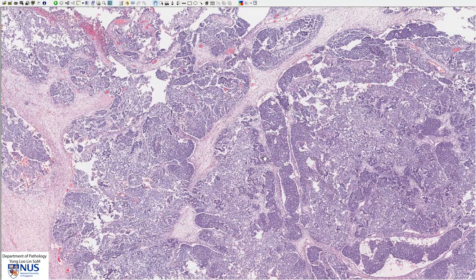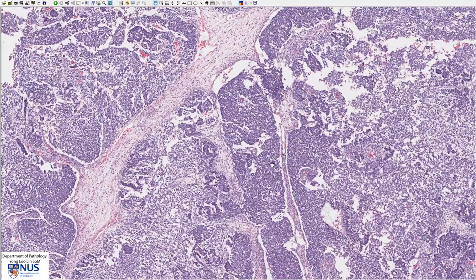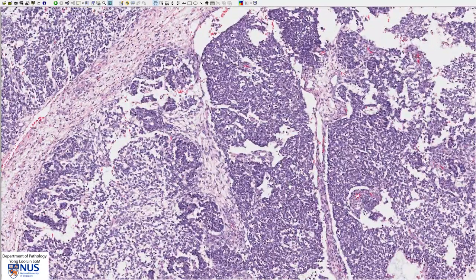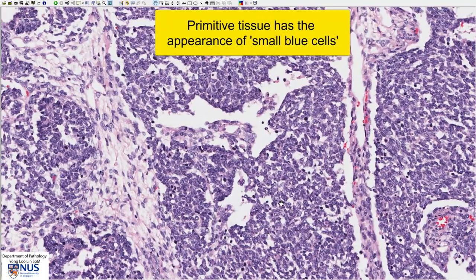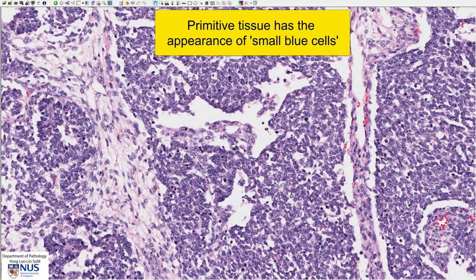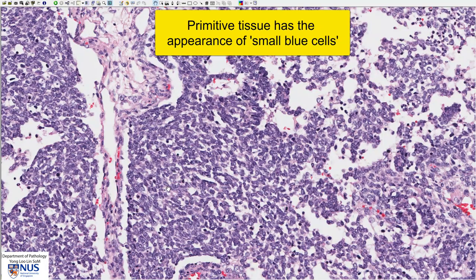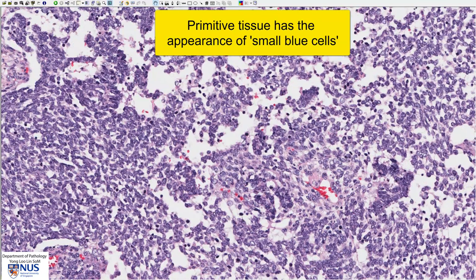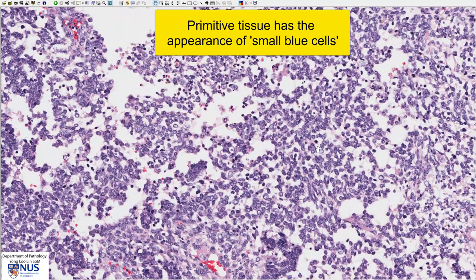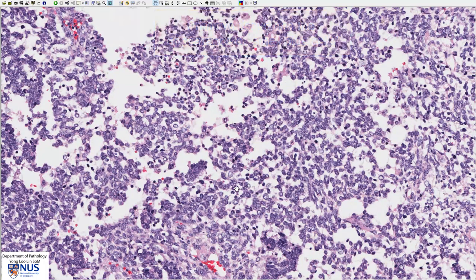In this area we can see a very blue appearance. Looking at higher magnification, we can see these sheets of relatively uniform cells with quite small nuclei, and there is hardly any cytoplasm. This is why the cells appear very blue at low magnification. Such areas are composed of the embryonal or undifferentiated type — blastemal tissue or blastema. This is the least differentiated component. Usually we will see many mitotic figures in such areas. These cells can form sheets, nodular areas, or serpentine elongated sheets.